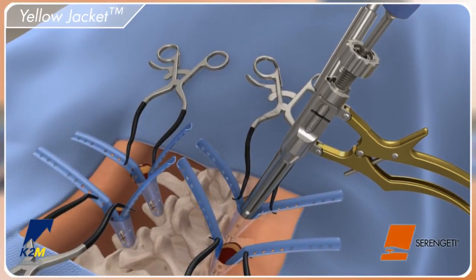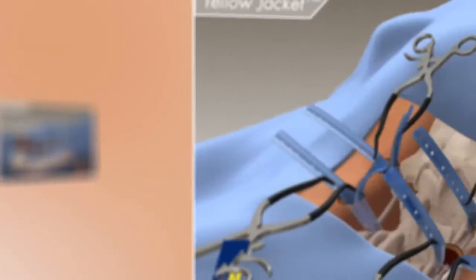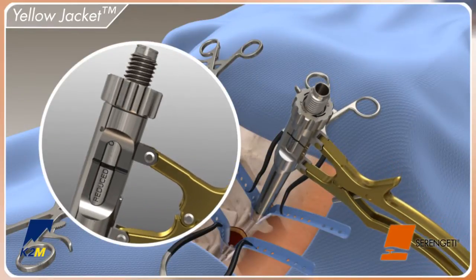Attach the set screw to the provisional screwdriver and pass it through the yellow jacket into the implant housing. For controlled reduction, attach the yellow jacket and turn the proximal knob. The instrument window will indicate when the rod is fully reduced into the screw head.